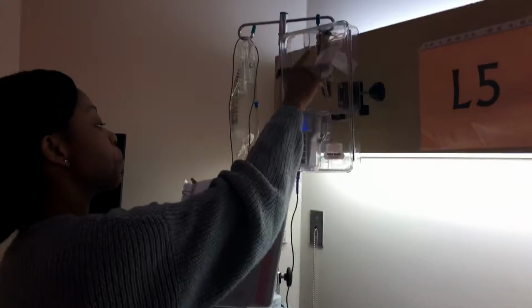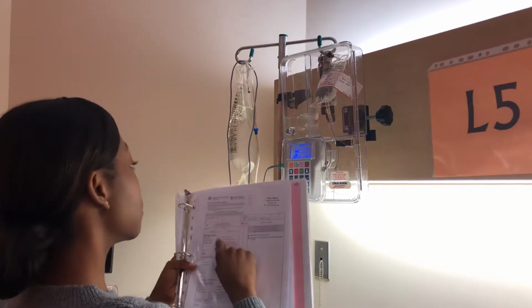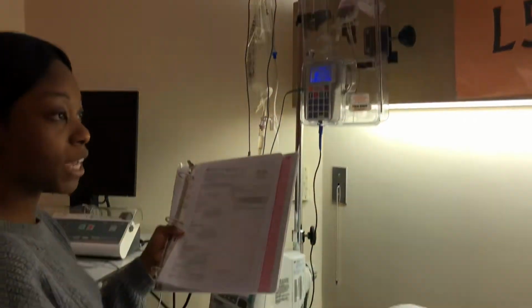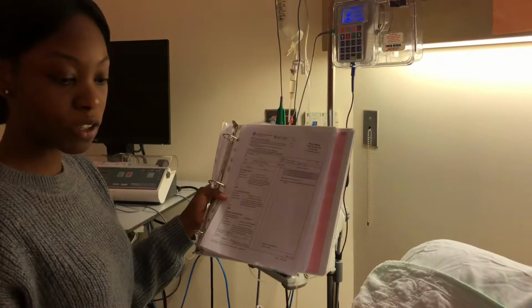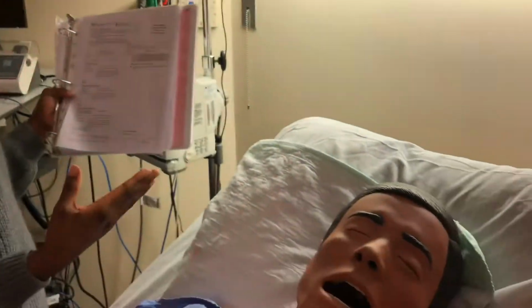So right patient, Paris Mercy, can you state your name? Paris Mercy. Right drug, we have morphine, and right dose is 1 milligram. We put in 1 milligram here. This is 1 milligram. And right route is going IV. Right time is 10:30 and it's due now. Right reason, patient has severe pain. And I also know the patient has a right to refuse this medication. And I already educated the patient that this medication is for pain.